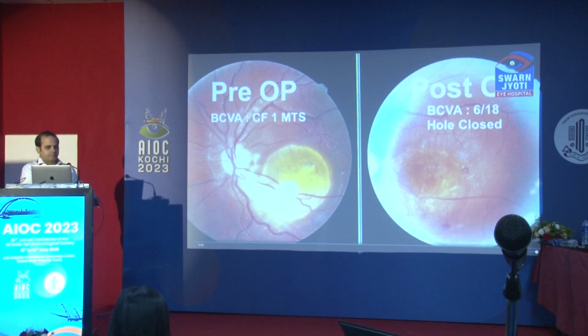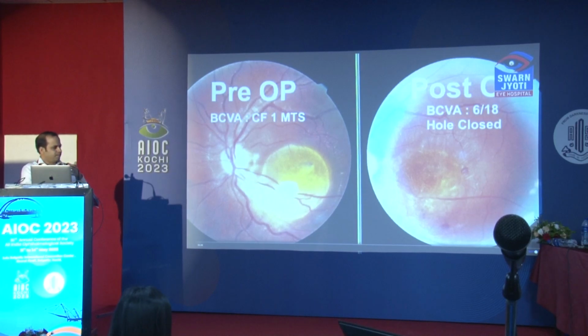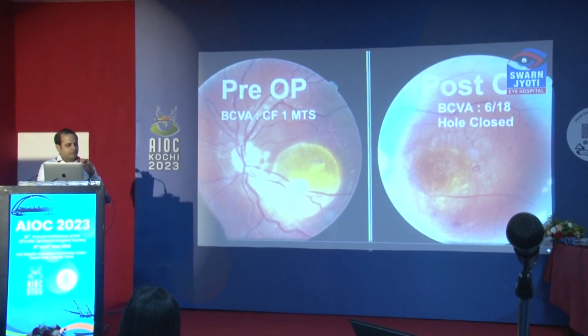Excellent surgery, Dr. Diva, and very meticulously done, and having a thorough workup is most important before actually going in for surgery. One thing we need to discuss is whether actually lasering that area would have been needed, or whether we could have just done an FAX. And secondly, if there is a bigger hole like this, which is very much in the posterior pole and in the macula, whether doing an ILM peel and just keeping it over that would have been an option.